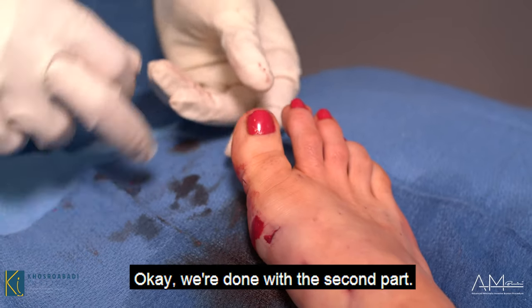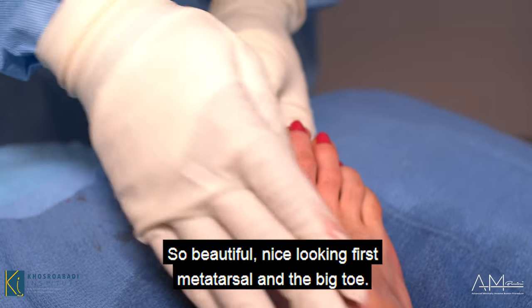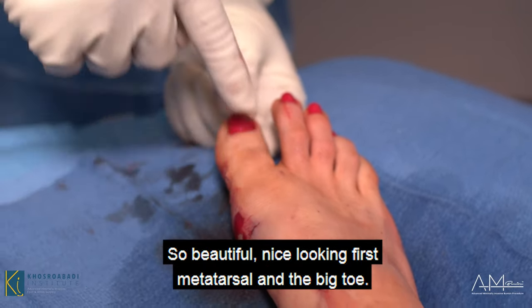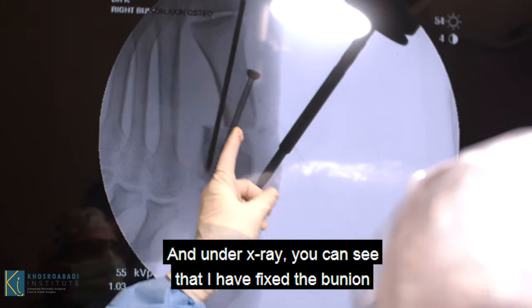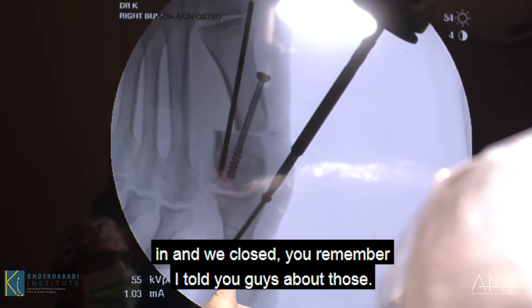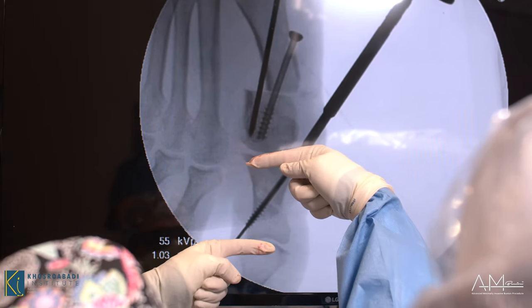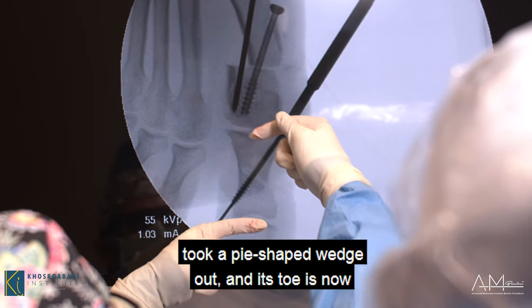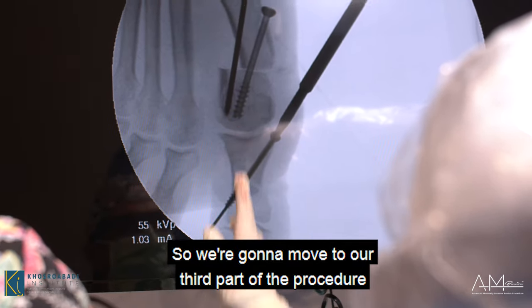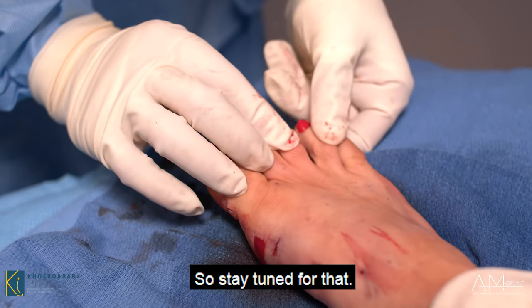We're done with the second part. As you can see, the toe is nice and straight, the bunion is fixed — a beautiful, nice-looking first metatarsal and big toe. On the x-ray you can see that I've fixed the bunion. Remember those lines I mentioned — they're now parallel. We closed this gap, took a pie-shaped wedge out, and the toe is now nice and straight.